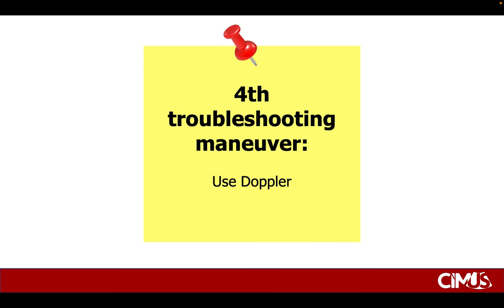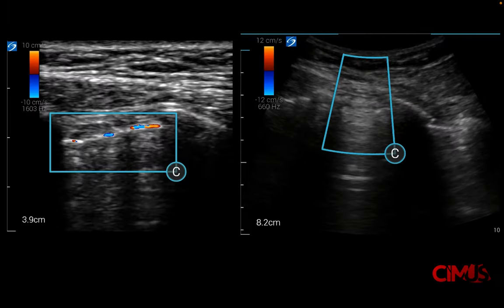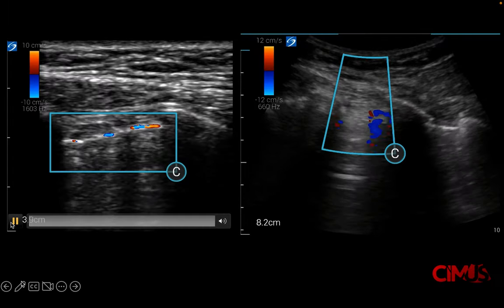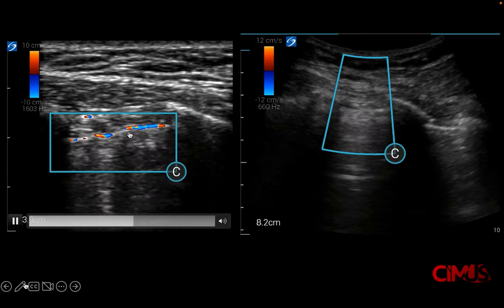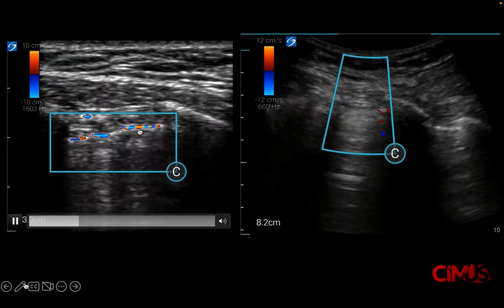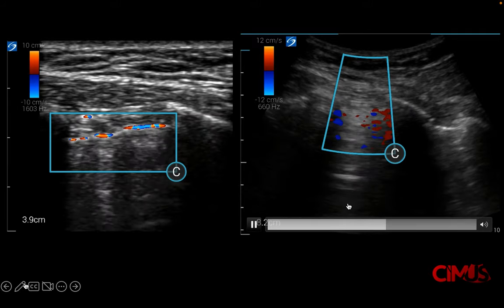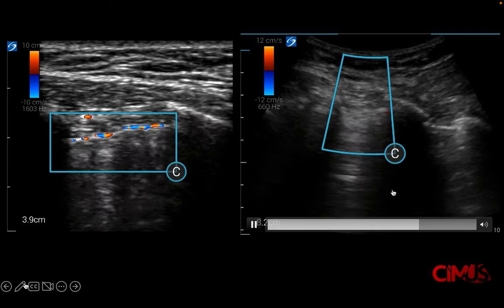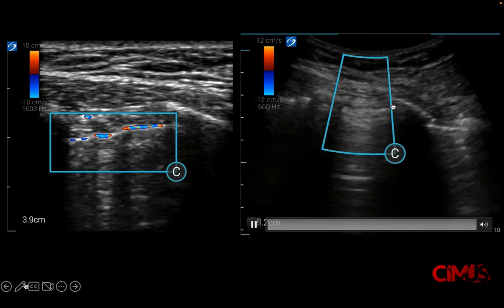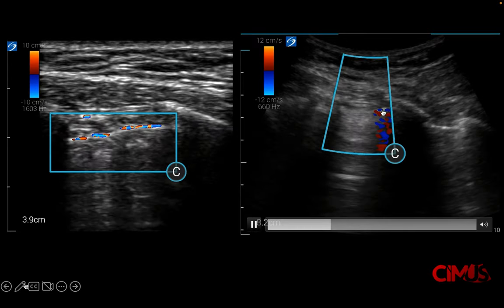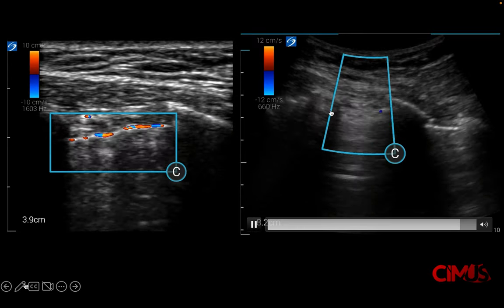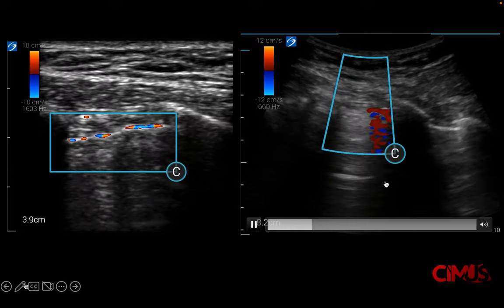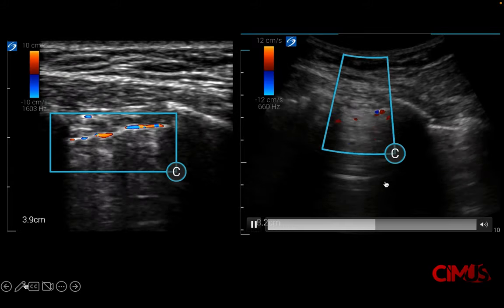If you still can't tell, there's the possibility of using Doppler. On the left clip using a linear transducer, the movement of the pleura is highlighted by color Doppler. On the right using a curvilinear probe, movement of the pleura and deep to the pleura is highlighted by color Doppler, as seen on this slide.